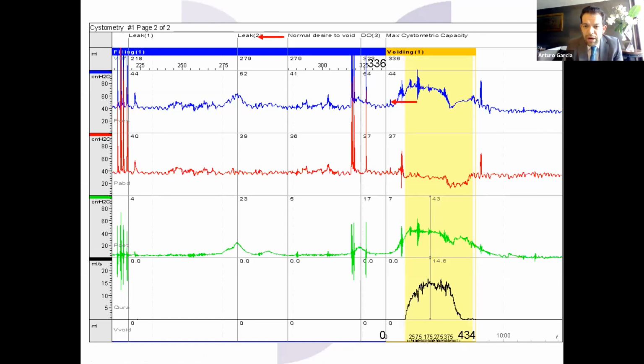So remember, a cough before voiding, this is a slight clearing of the throat before voiding. Then the patient voids, and I have another cough after the void. So I know everything measured from here to here is reliable. Remember, this is going to cause an increase. This decrease in abdominal pressure is this increase in the detrusor pressure.